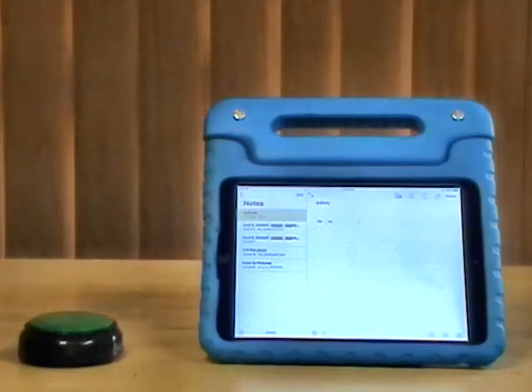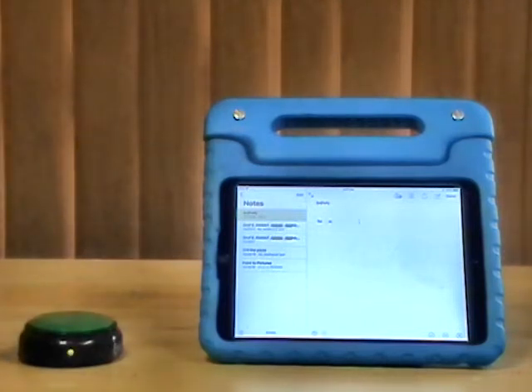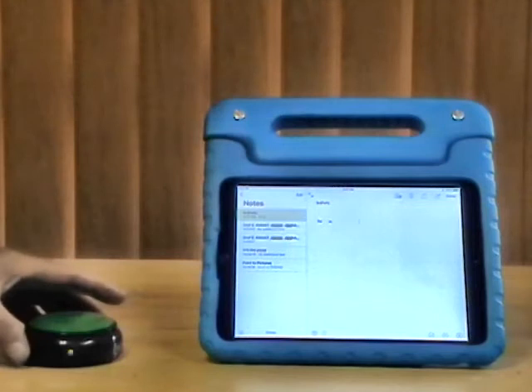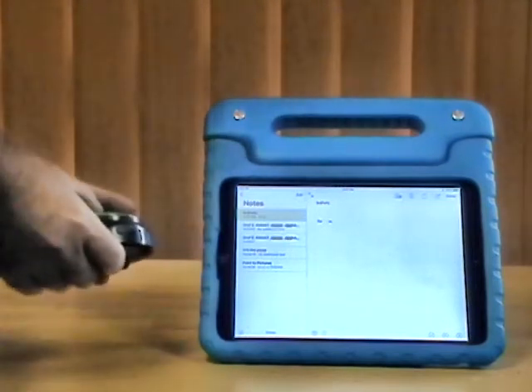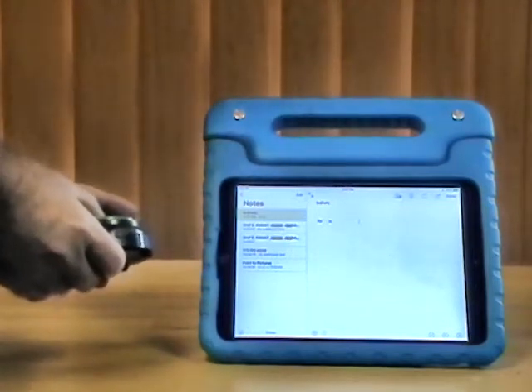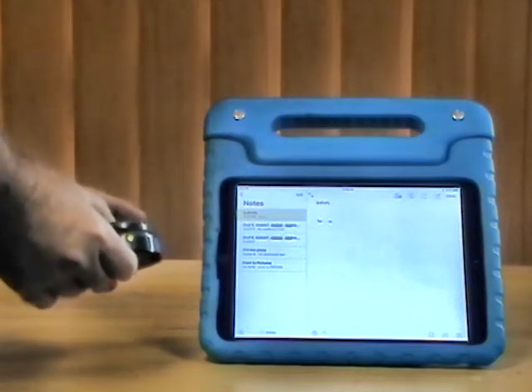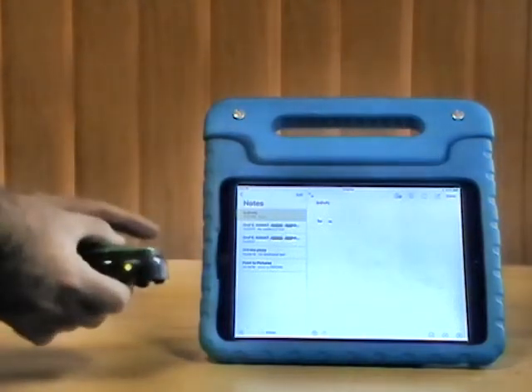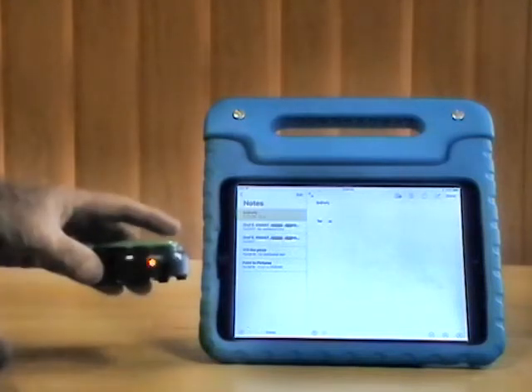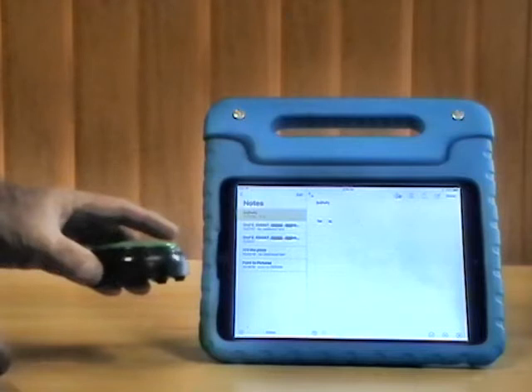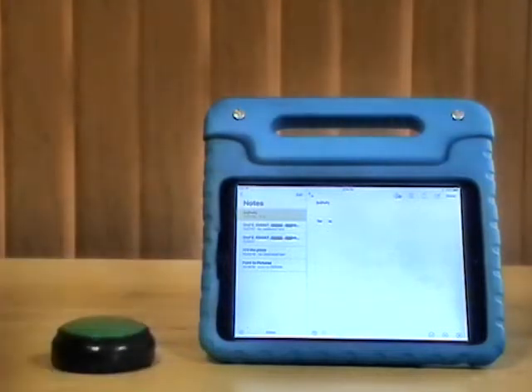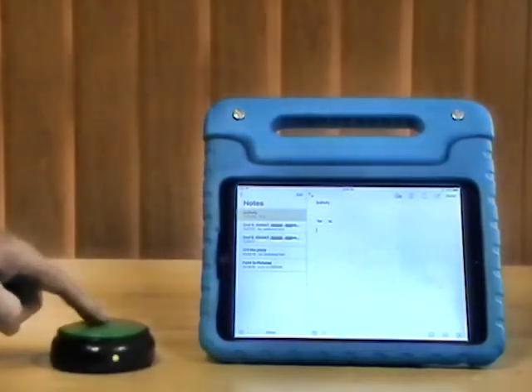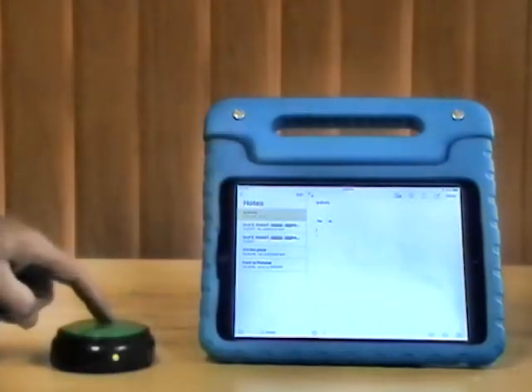If you wanted to step scan using two switches, you can have one set for space and then very easily press and hold the green button for five seconds. After the second red flash, the BT small switch will do an enter, wrapping the cursor down.